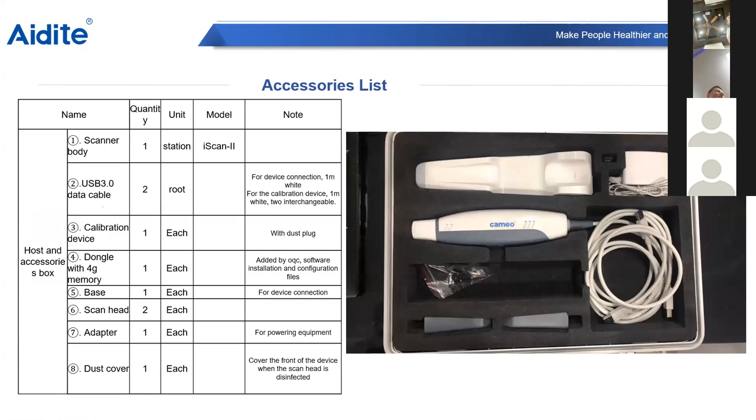It comes in a very small case. And the laptop, I cut out the upper part of the foam. Even the laptop fits in it. So now I've got everything in one case. So I can go to the dental office, I can go to dental hospitals, and also dentists really like it if they have to go to old people's houses to scan away from their office.